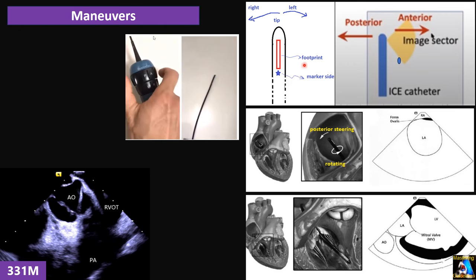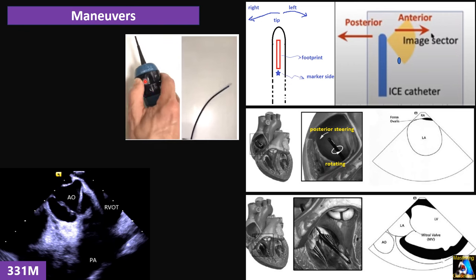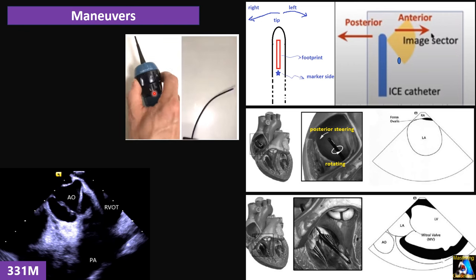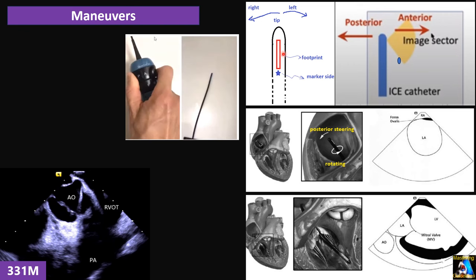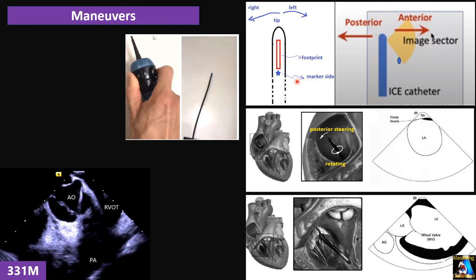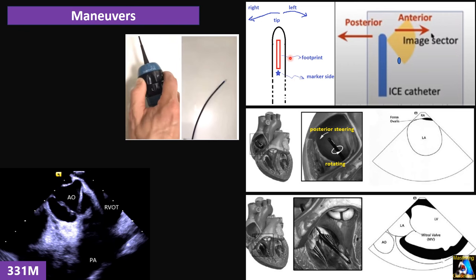Then we have steering at the handle of our probe. Depending on the machine, it is a knob or some pushing, twisting, or pushing up and down, or twisting left and right, depending on what type of transducer and what vendor you use. But generally, in all of them, we have these four steering movements.